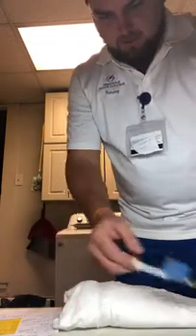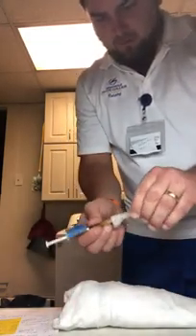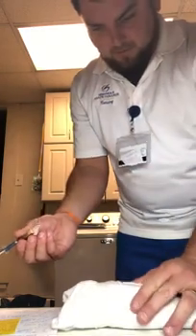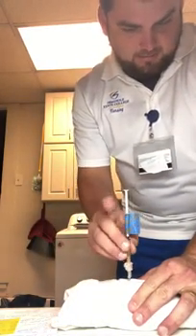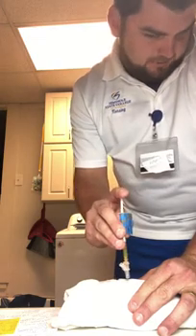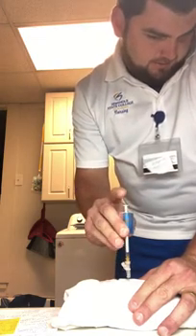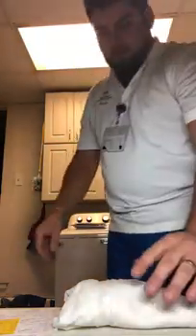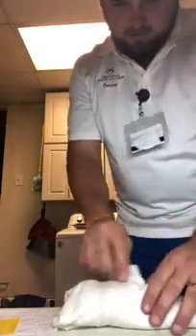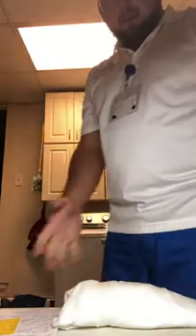Okay. We're going to remove the needle, and we're going to pinch it up nice and good. We're going to stick it in, and we're going to inject the fluid, and we're going to pull it out and release and recap our needle, and we're going to put that in the sharps container, and tend to this if we need to, put some gauze, a little Band-Aid on it, and ask the patient how they feel.